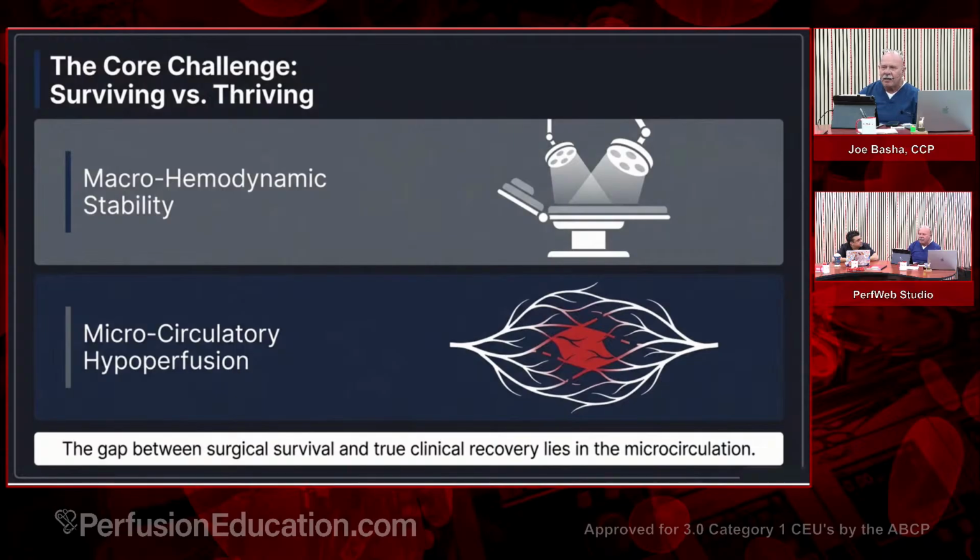Anyway, we went on bypass, and man, we struggled and struggled and struggled with, okay, we're now giving Neo, a stick at a time. Okay, that's too much. We got to switch to something else. So we switched to norepi. Norepi, we're giving more and more. They're running a norepi drip. They're up to 10 mics a minute, 12 mics a minute.